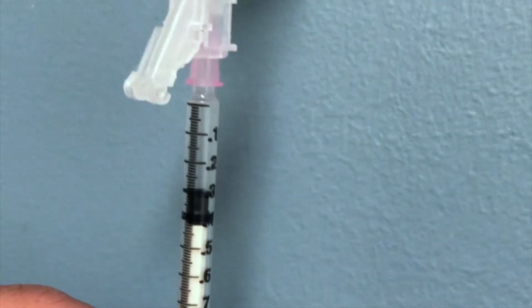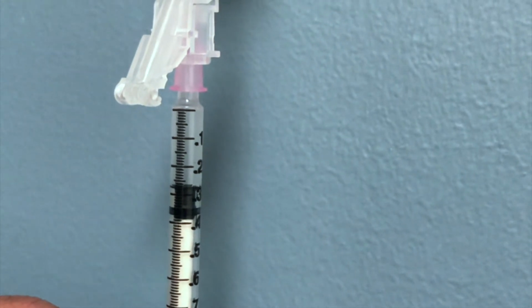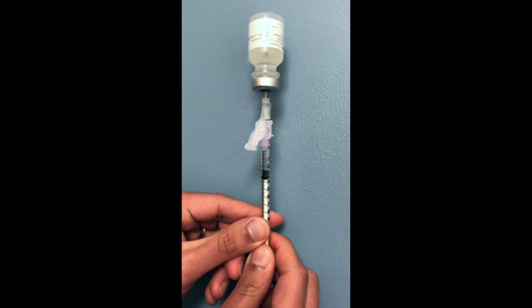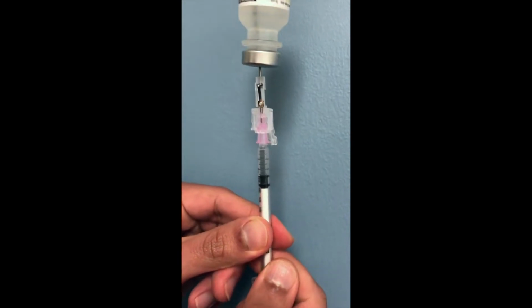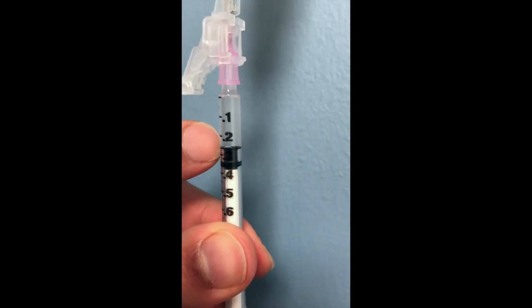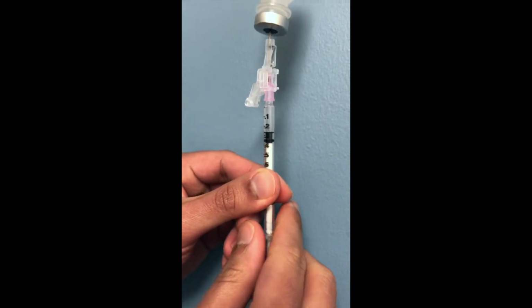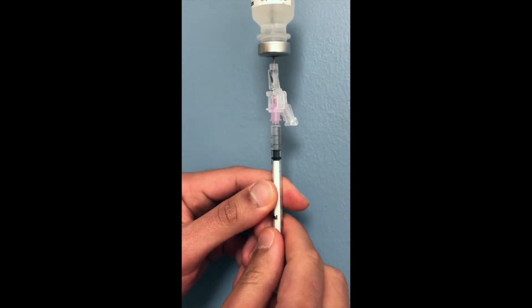Here's 0.3, and you can see the medium-sized hash mark right in the middle, and that's 0.25. So that's where you want it to be. One thing to add here is that you might notice that there's a tiny little air bubble right there. Tiny little air bubbles like that don't really matter. Sometimes folks get worried that that might hurt them. It actually won't. So it's okay to just leave those alone.